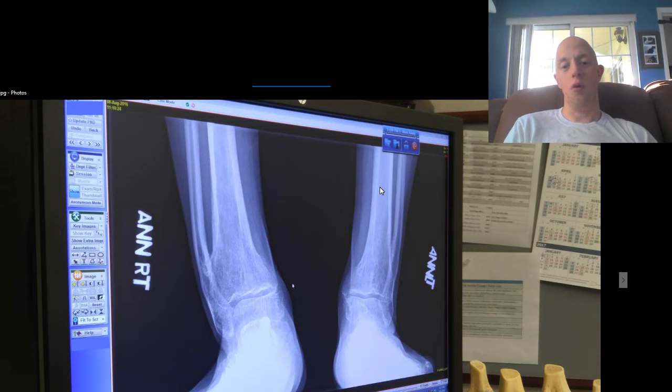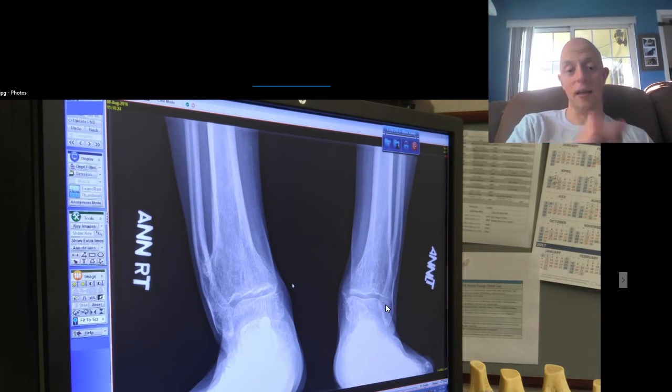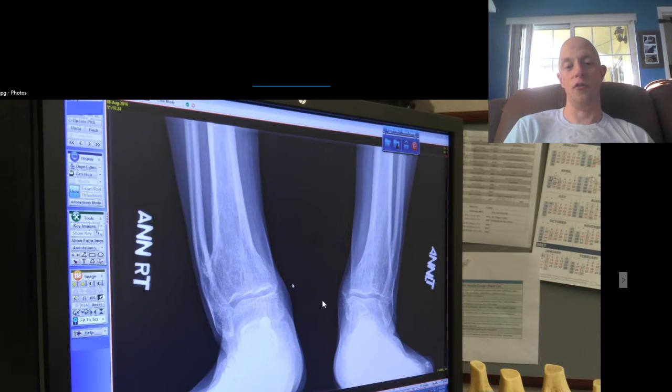Don't get me wrong, the left leg as well has some of the bowing action here. However, it's nowhere near as great. And as you can tell, the bones are extremely clear — it's nowhere near as cloudy as what the actual right ankle is.